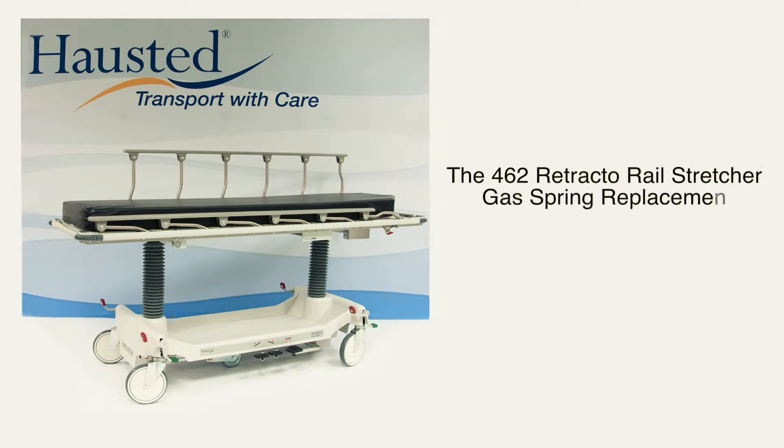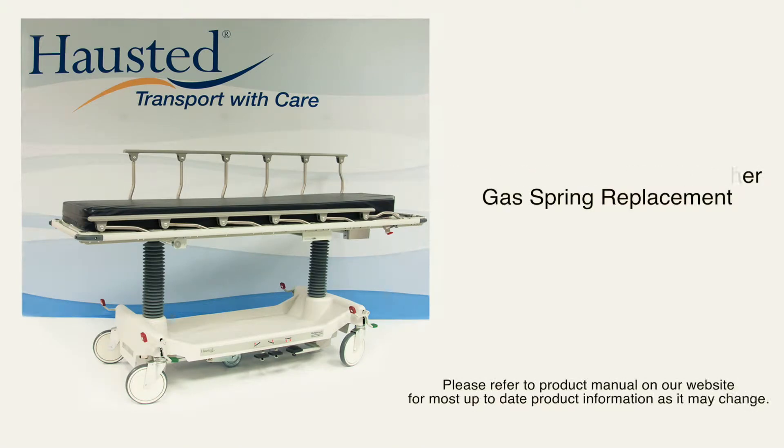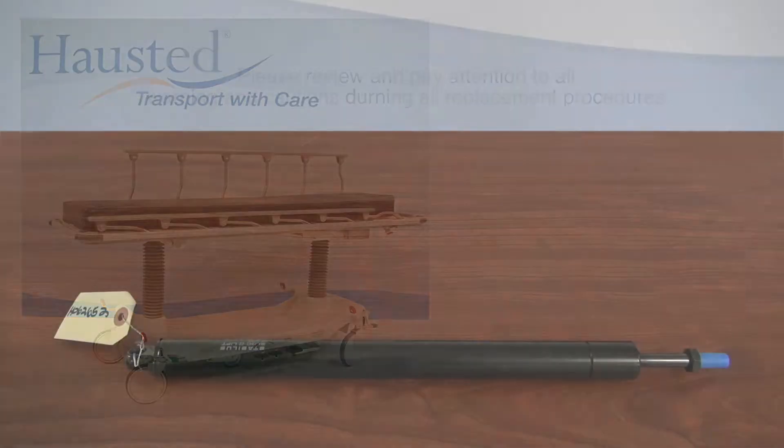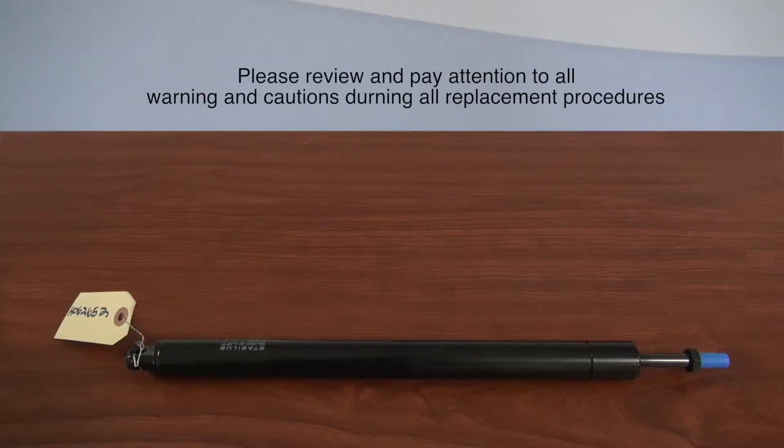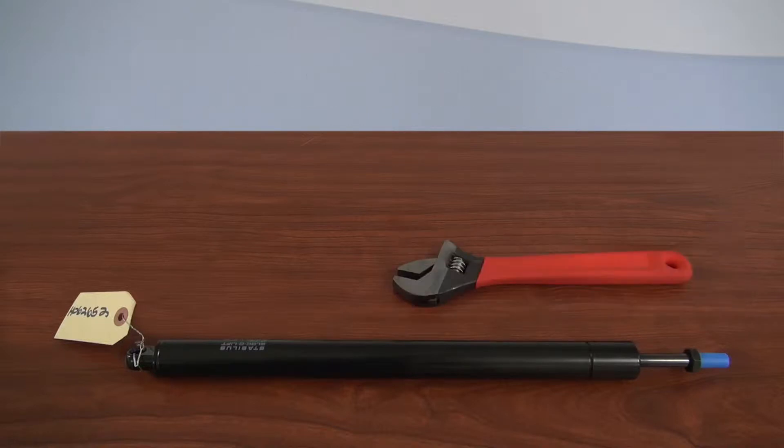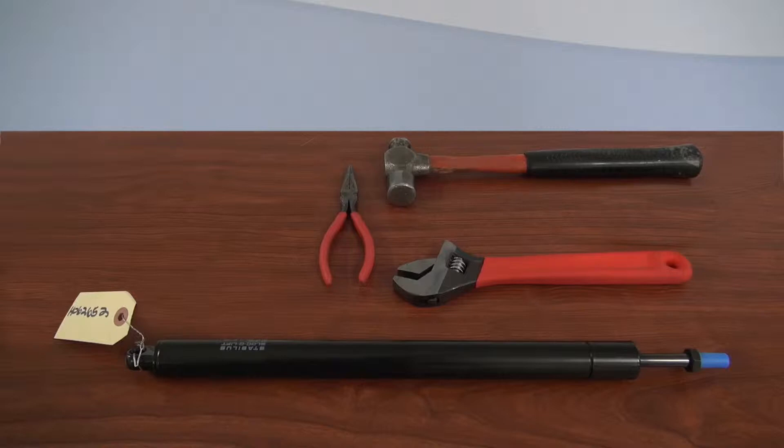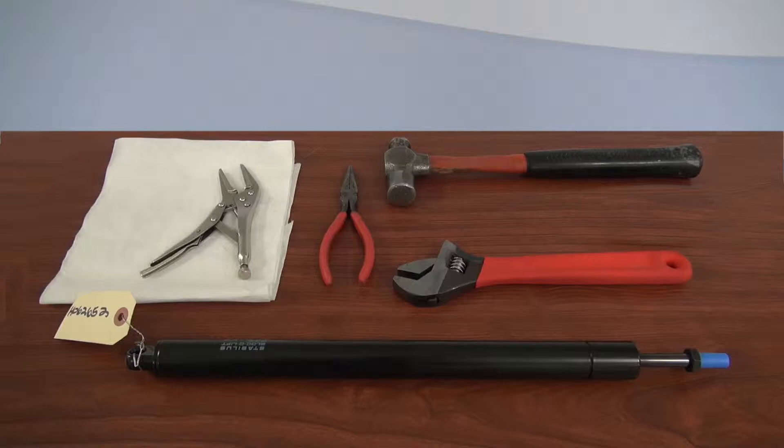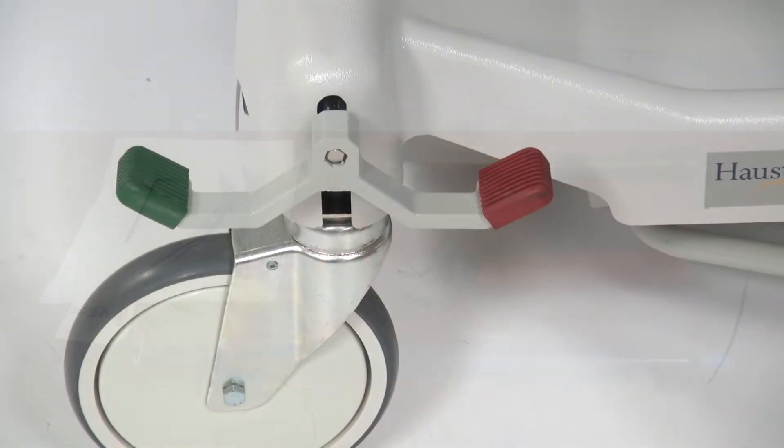462 Horizon series stretchers gas spring replacement. Tools that are required for this replacement procedure: new gas spring replacement part, crescent wrench, hammer, needle nose pliers, paper towel or cloth, small vice grips, and a 3-32nd Allen wrench.